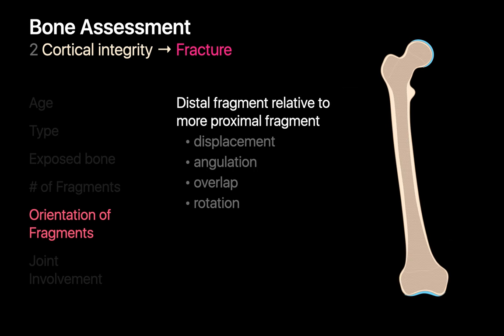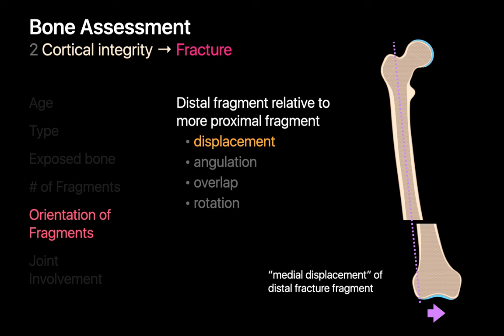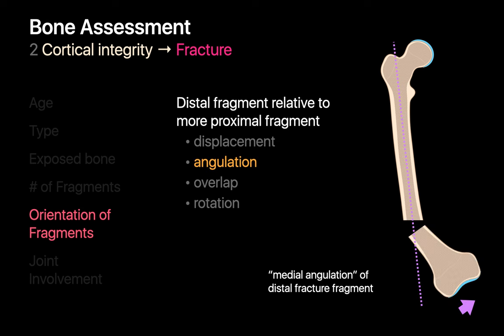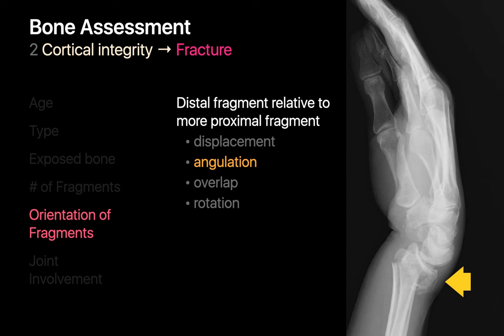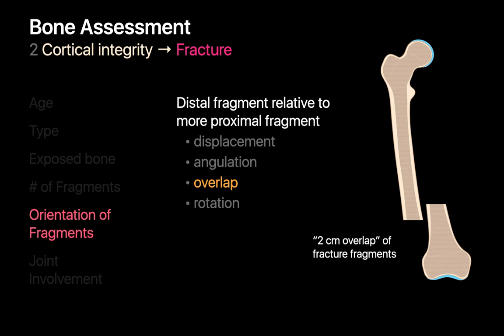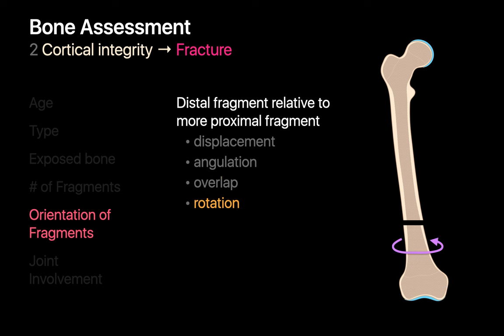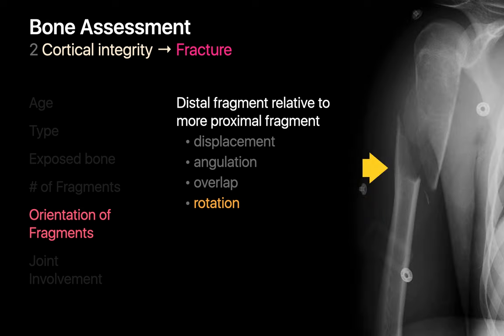Describe the location of the distal fracture fragment relative to the proximal fracture fragment. If the distal fracture fragment is displaced, describe the direction and amount of displacement. If the distal fracture fragment is angulated relative to the proximal fragment, describe the direction the distal end of the distal fracture fragment is angled towards. Describe if the distal fracture fragment overlaps the proximal fragment and if so, describe the amount. Describe if the distal fracture fragment appears to have rotated relative to the proximal fragment, like in this oblique proximal right humeral fracture.